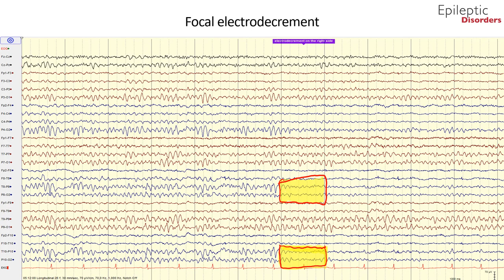The next type of seizure is a focal electrodecrement seizure. This page was taken from a patient with drug-resistant focal epilepsy. In the 7th second of the page, highlighted in yellow and outlined in red, you can see over the temporal and parietal T8-P8, parietal-occipital P8-O2, as well as T10-P10 and P10-O2 chains, a focal electrodecrement which represents the onset of a seizure.